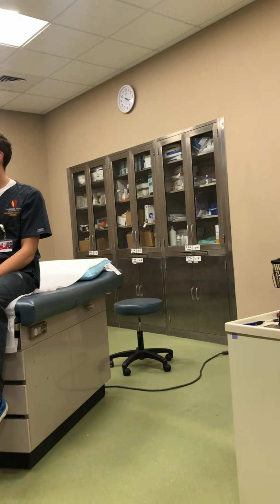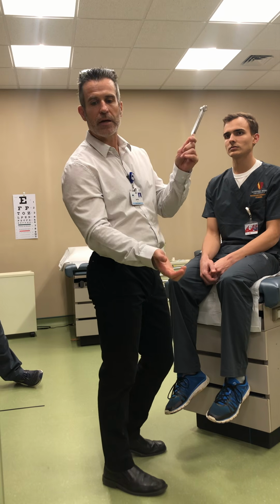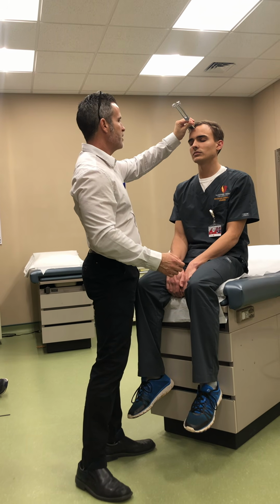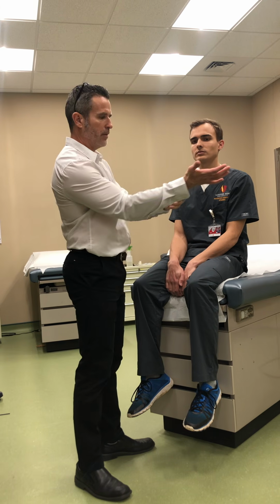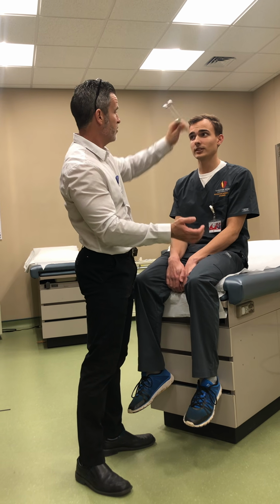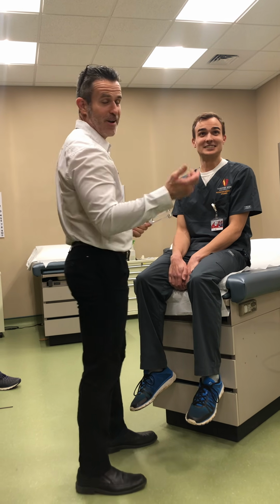So Weber and Rinne use a 256. For the Weber, you want to hit a little bit harder. Hit on your palm. Everybody hears that, okay? So I want you to tell me if this lateralizes to the right ear or left ear, okay? Or does it stay midline? Kind of went more to the right. Let's do it again. Double check. Right? Going to the right? Yeah. Do you have any issue of hearing loss? No. Last time, tell me where it goes. Right. Okay, so we have an abnormality here.